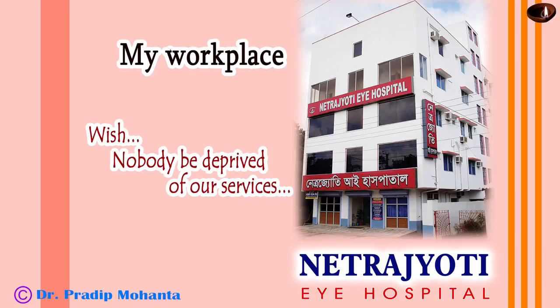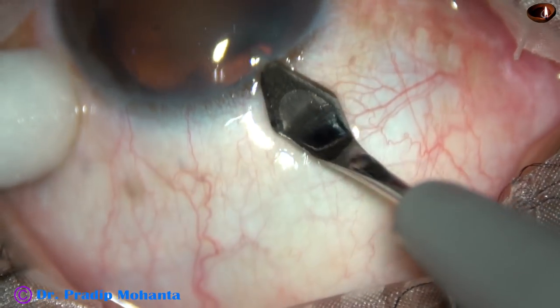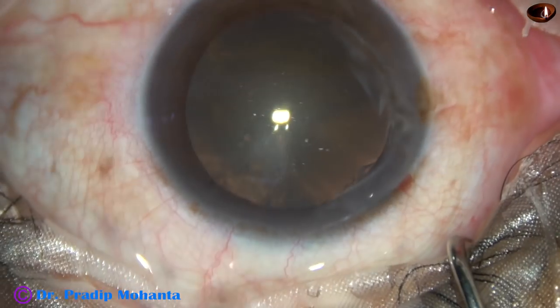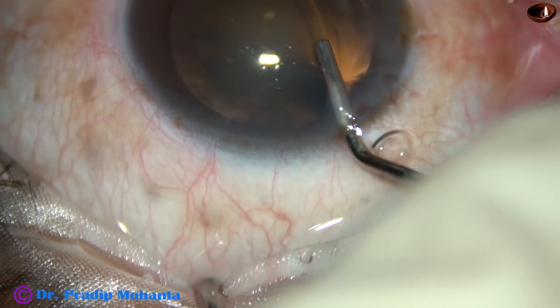Friends, welcome to my workplace at Ranaghat, West Bengal, India. This is a soft cataract. In this case, I have attempted pre-chop with 27-gauge hydrocannula. Let us see how it went.